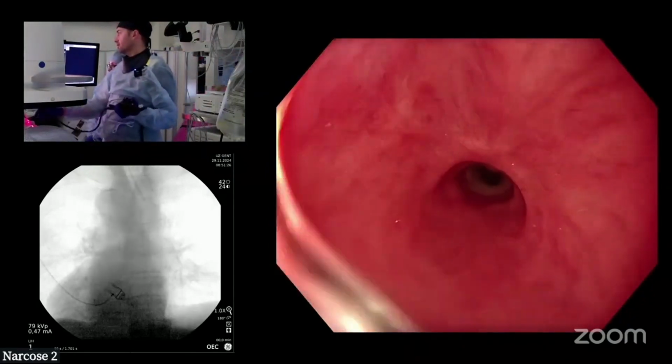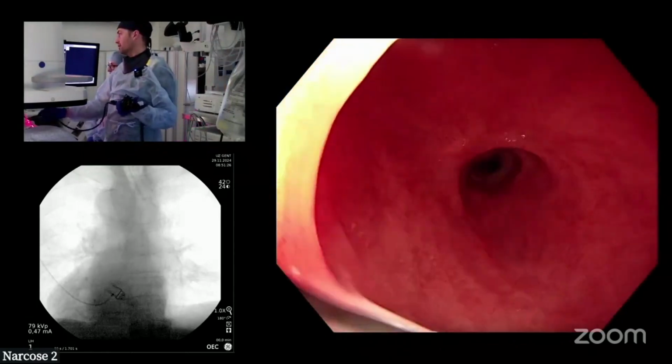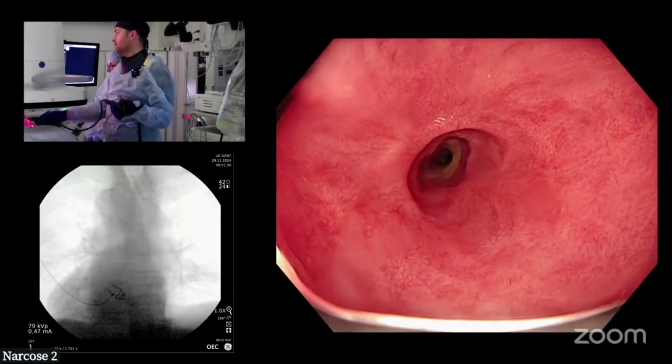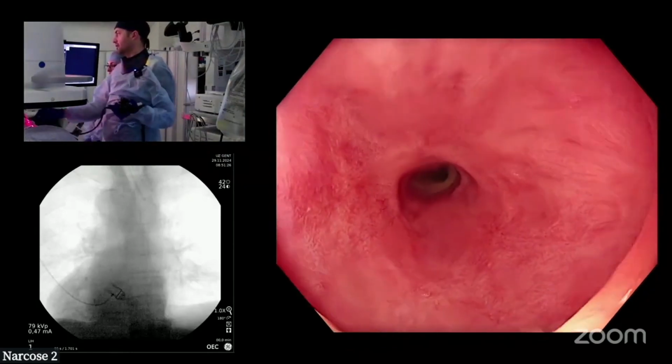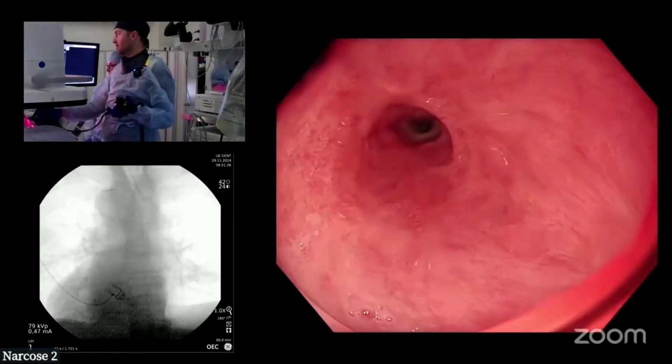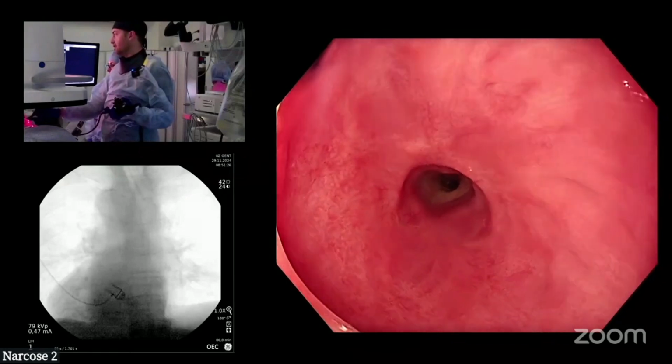Yeah. So the first question is, can I pass? Because if I can pass, then okay. So how do you try to pass in a deconstructed way? What should you be trying to do? In my view, you should be trying to center the endoscope in the stenosis, right?